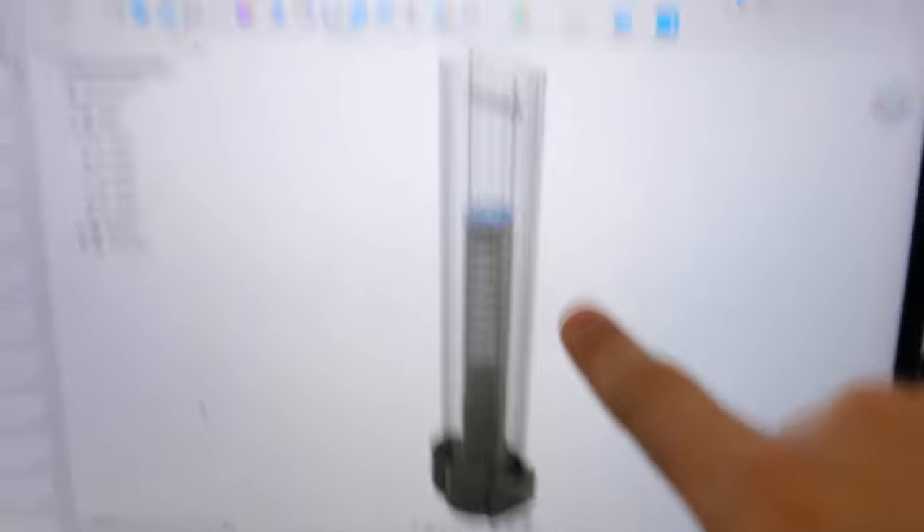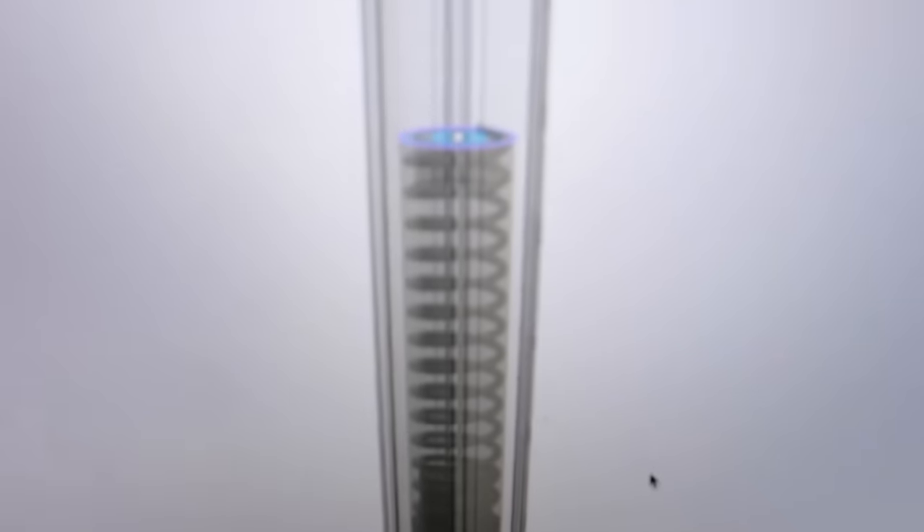This is the design I came up with for the pogo crutches. This barrel here is what is going to replace the center bar that we took out using the drill. It's going to attach with one long screw across the top and then two smaller ones along the bottom, and we'll have a six-inch spring inside of there bouncing up and down. Now that we have the parts, let's go hit the 3D printers.